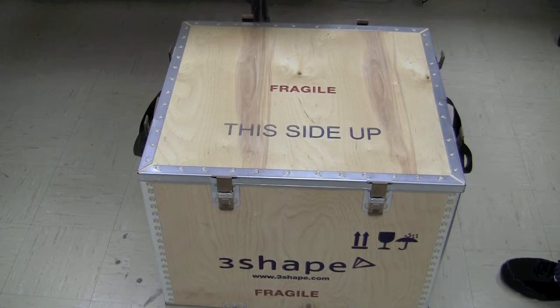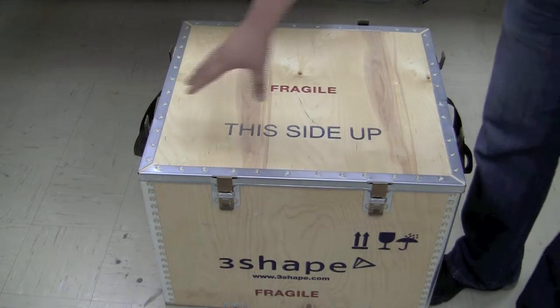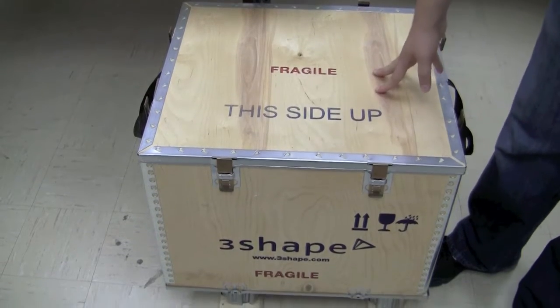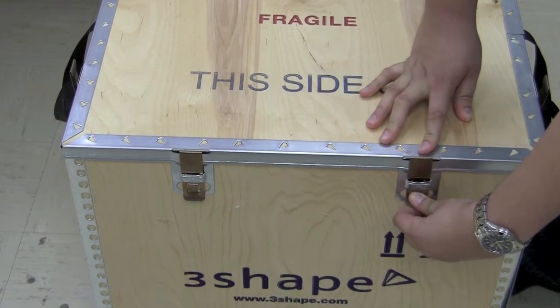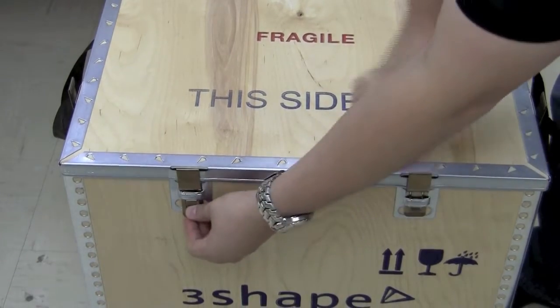This is the crate that your 3Shape scanner is going to ship in. It's going to include eight different tabs that fasten this lid down in place. I've gone ahead and loosened six of those eight. To unfasten these clips, push in on the little tab below that silver clip and push straight up — the tab will just pop right out.